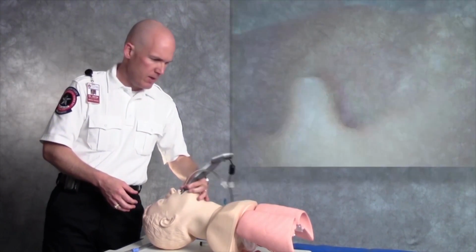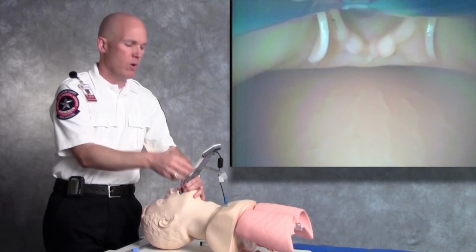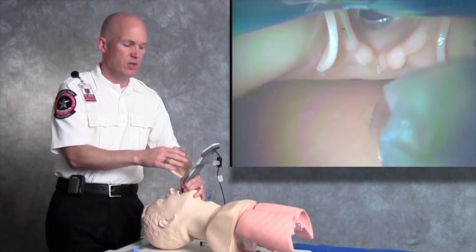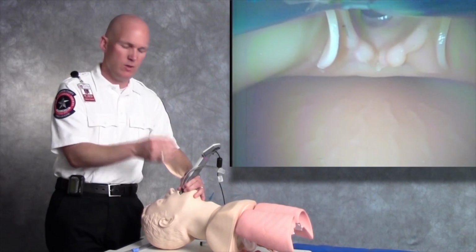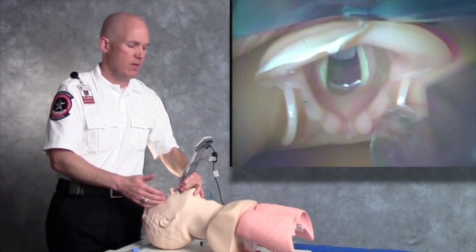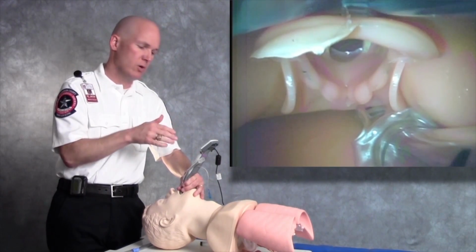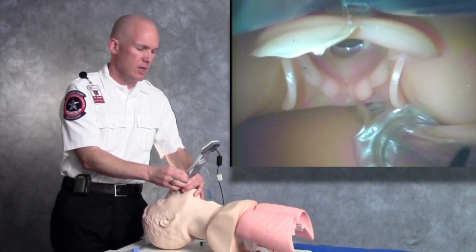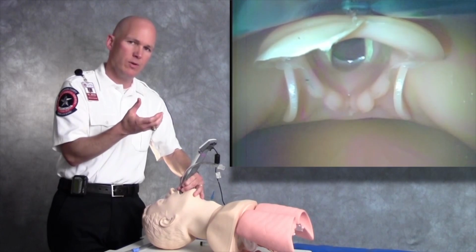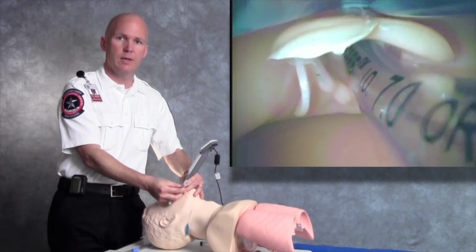So they go in and they still manage to, unintentionally, go too deep. Before realizing it, they start to advance the tube. So they realize it's not going. They leave the tube. Instead of backing it up past the view of the camera, they leave it extended. Now they back the tip up. They get the view, but they try to advance the tube and it's still going posteriorly. So the solution is you need to back the tube up to where you can't see it anymore. Now there's enough of a bite from the channel on the tube for it to go right in.